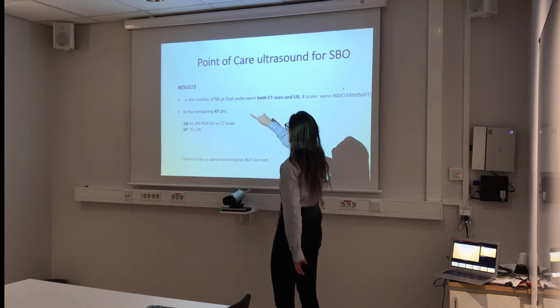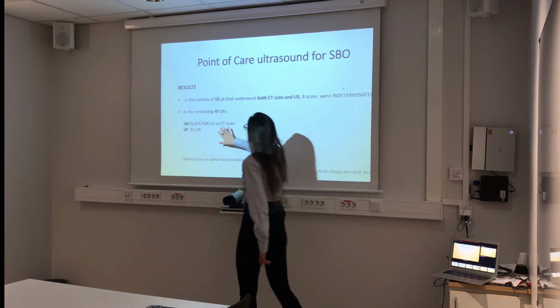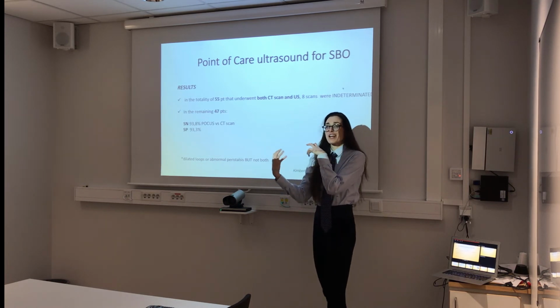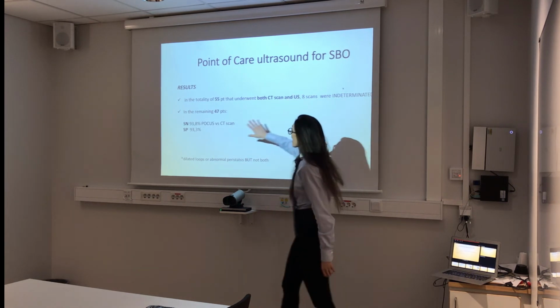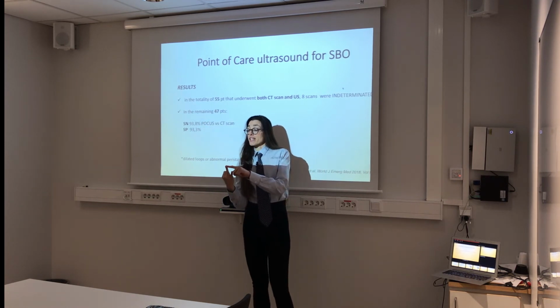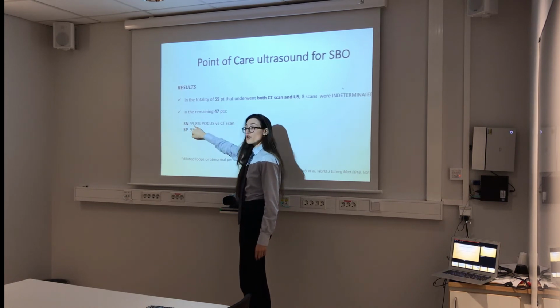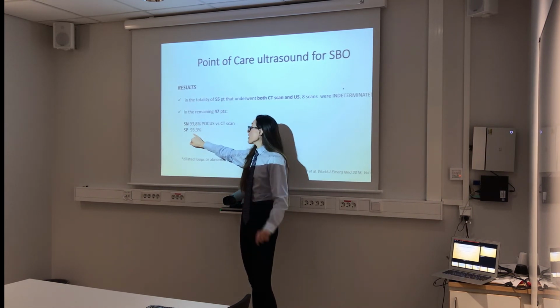Of the 55, all patients had both CT scan and ultrasound. What happened basically? 8 scans were undetermined, a gray area where the sonographer was unable to say ileus, subileus, I'm not sure. So they took those away, and we go to the real one, the 47 total that had a CT and an ultrasound. What was the sensitivity and the specificity? The sensitivity of point of care ultrasound compared to the CT scan was up to 94%. That for me is a very good number. And the specificity was up to 93%.